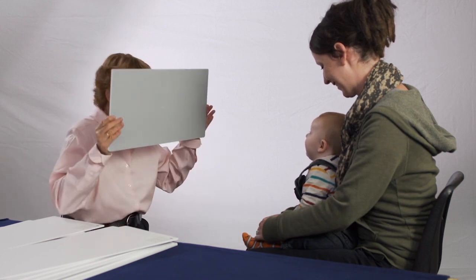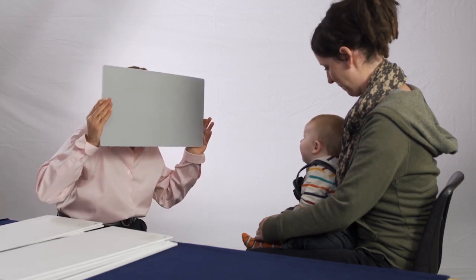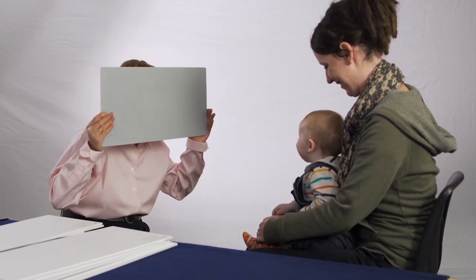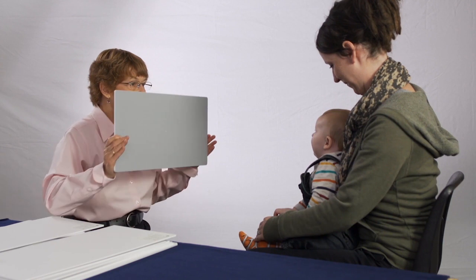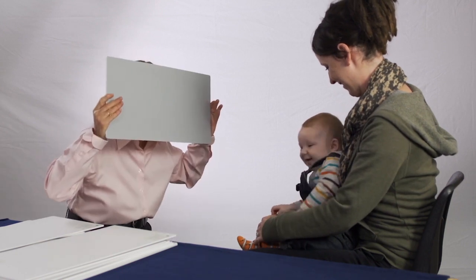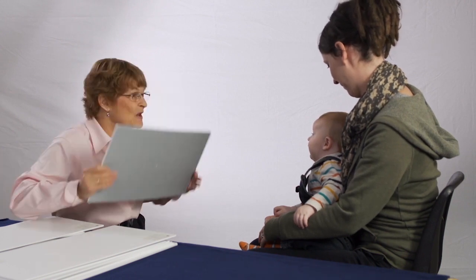At some point, the series of judgments will become difficult, and the examiner may be unsure whether the patient detects that grating. The examiner does not look at the front of the card for this grating location. The examiner places the card the infant does not detect on top of the not seen stack. The examiner then retests the previously seen grating, and if she judges the infant detects it, she places the card on top of the seen stack again. If the examiner still cannot determine that the patient detects the grating, this indicates that a below threshold grating has been found and testing is completed. The next coarser grating, the finest the patient responds positively to, is recorded as the patient's acuity.